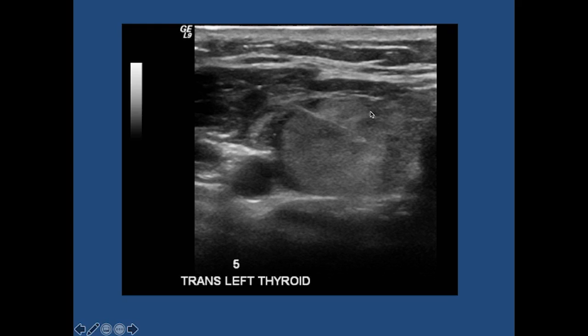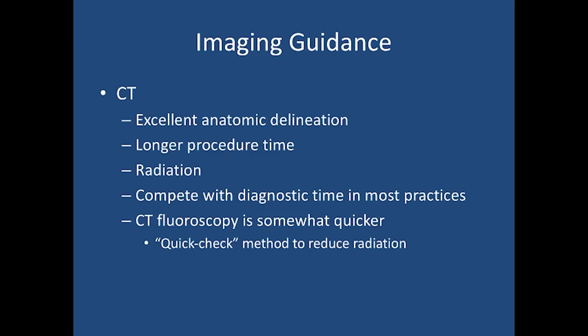In this example, we have a sizable thyroid nodule that is essentially 2 centimeters below the skin surface, and we can see direct real-time visualization of a needle placement into the thyroid nodule for sampling.